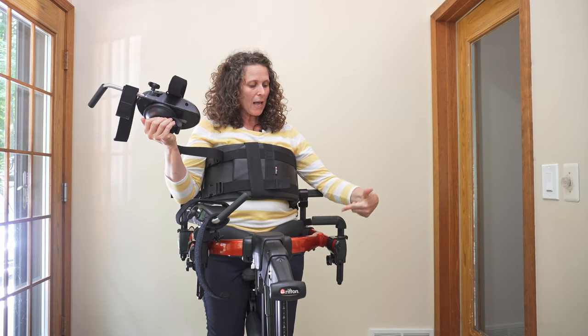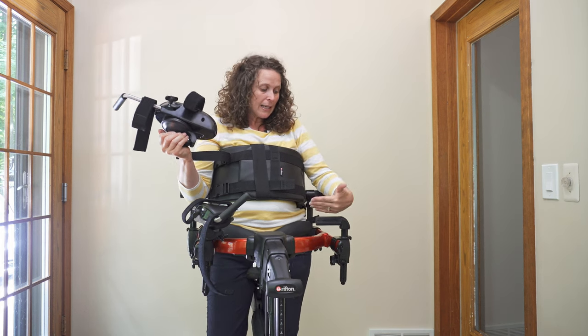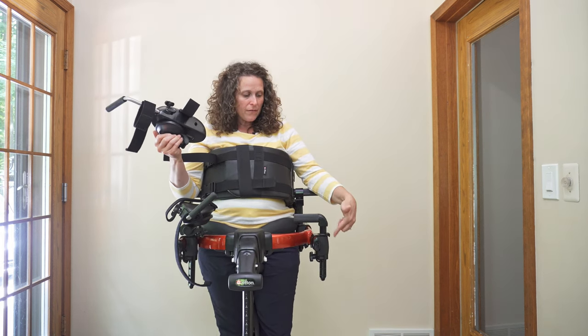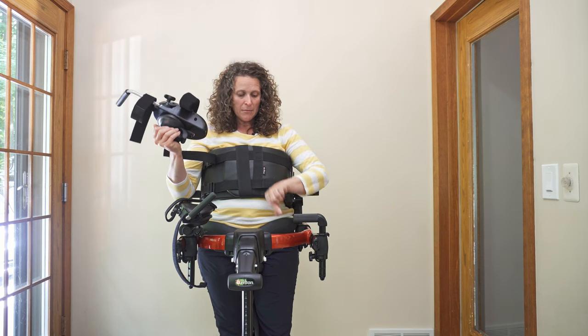You're going to want your L-bar facing in or facing out — I would start with it facing in. You can either have the bracket on the outside of the frame or the inside of the frame, depending on how large the person is that you're working with.